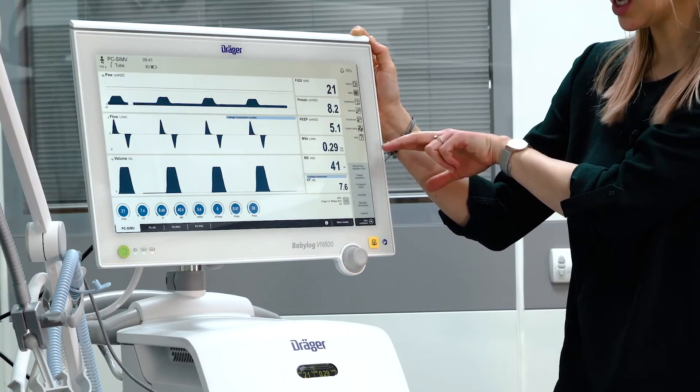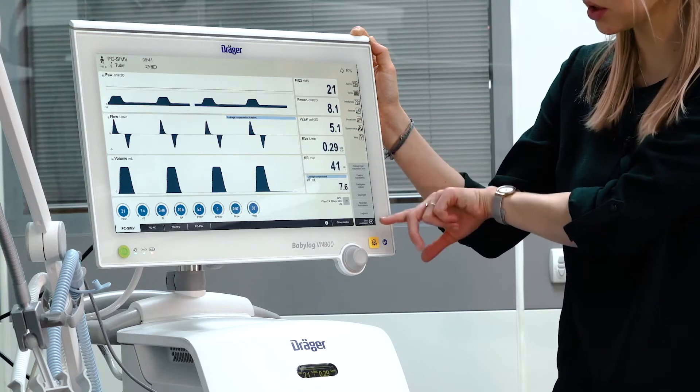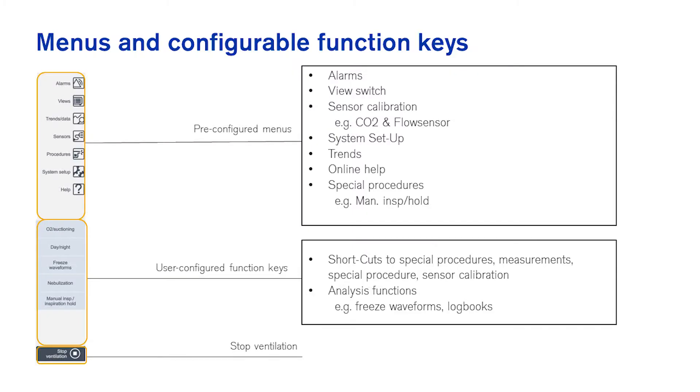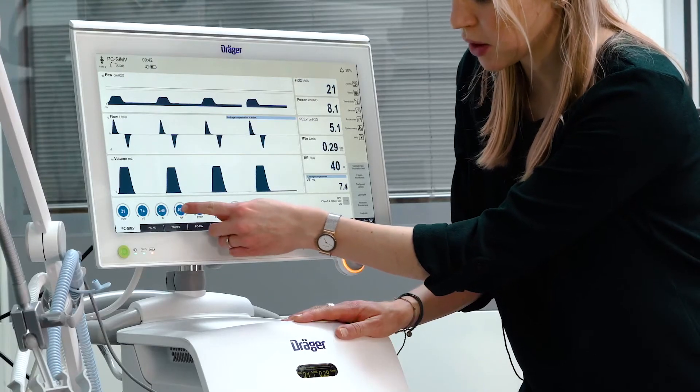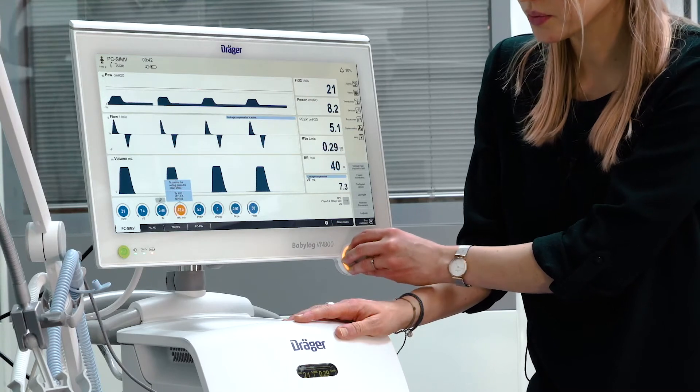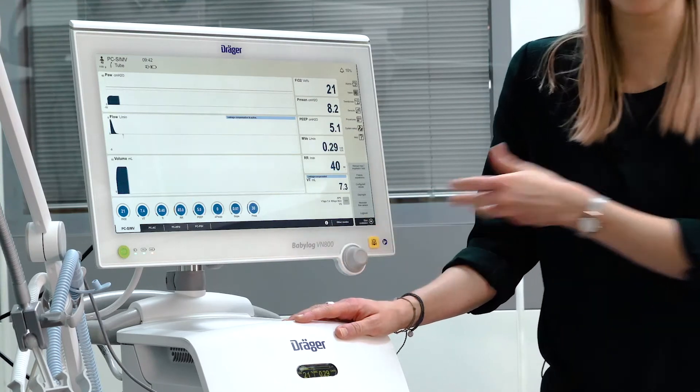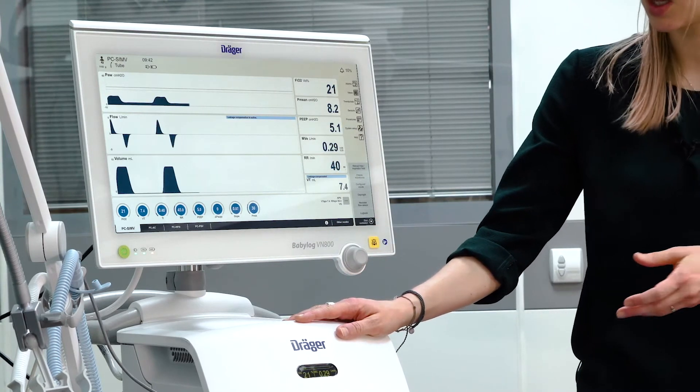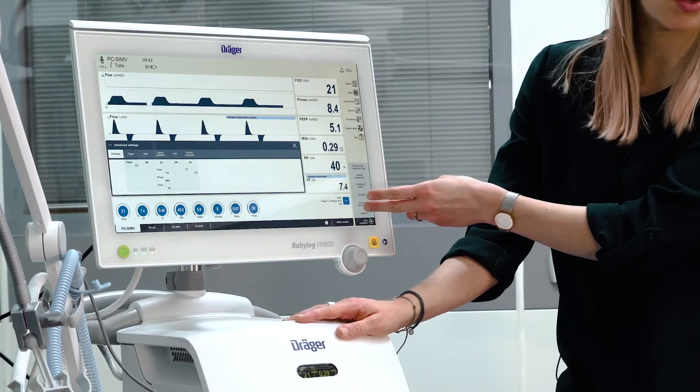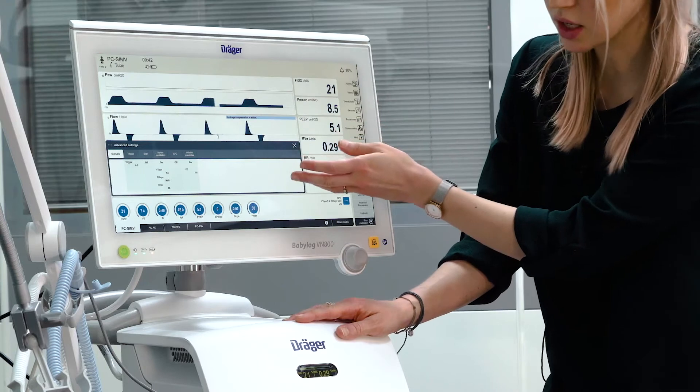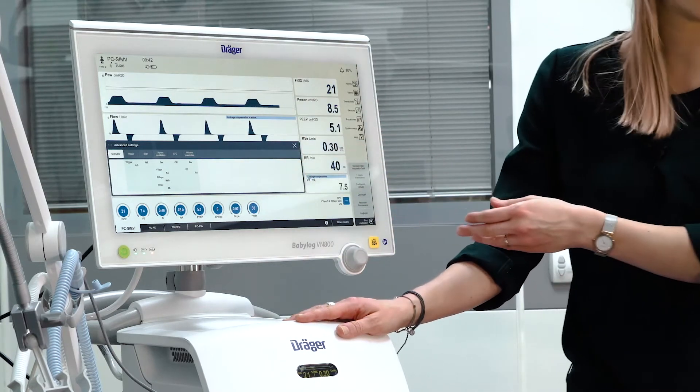In the right hand side, you can enter further submenus and you can find configurable function keys. Select the respective parameter and set it to the desired value. You can confirm by pressing the rotary knob. Via the three dots on the right hand side, you can enter the advanced settings and apply changes if necessary.